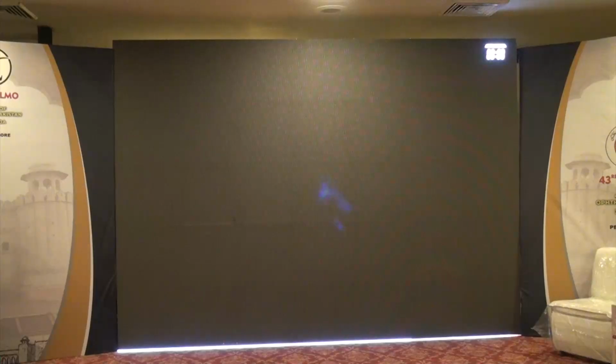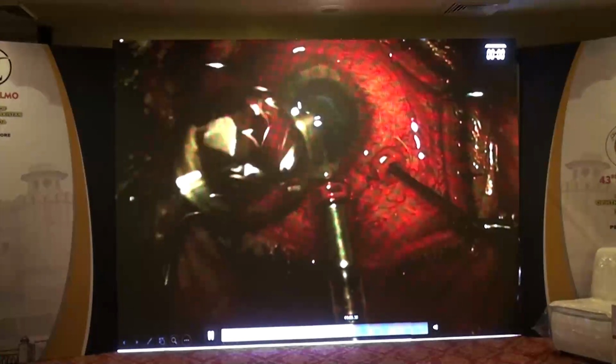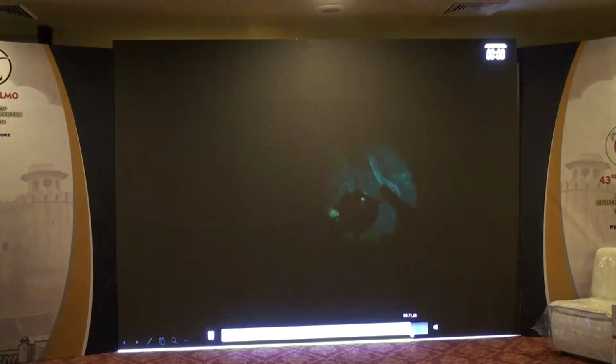So once we remove the lens, then we have to deal with this very ischemic retina, which is detached with multiple epiretinal membranes, severe PVR. So again, we have to do bimanual peeling. In these cases, you can't do anything less. And finally, we have managed to attach the retina and oil the eye.